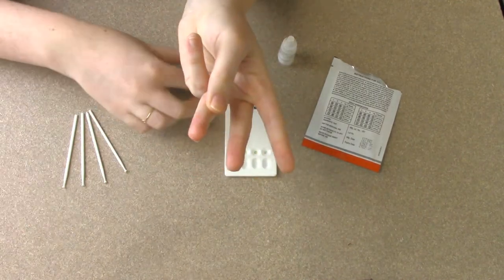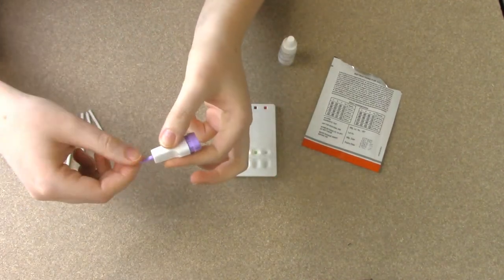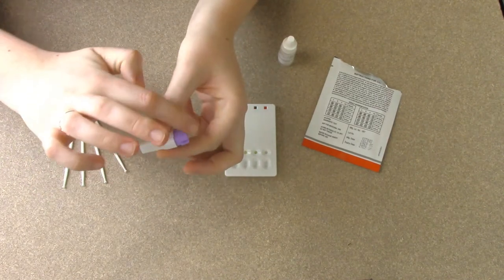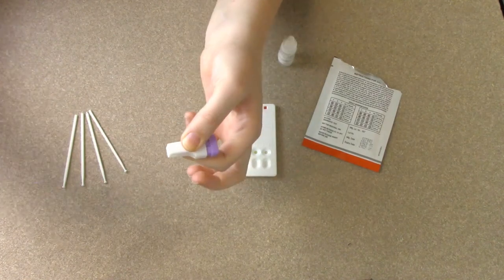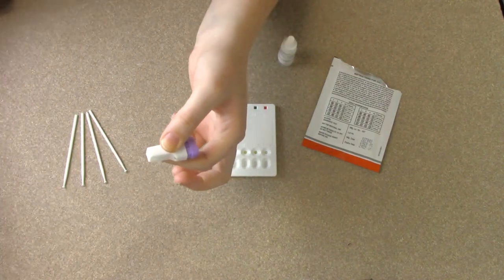The next step is just to remove the protective cap on the thin end of the lancet. So it's not this end here, it's this little thin end, and you actually twist and pull and the lancet is now ready to use.